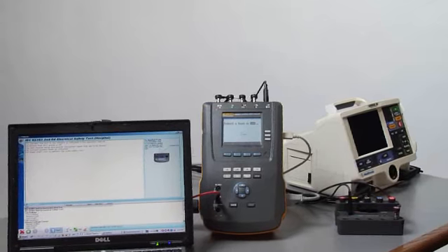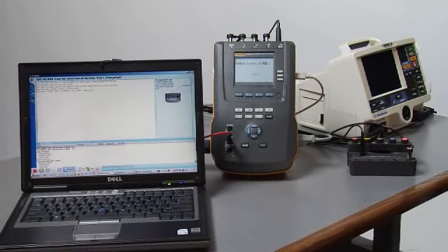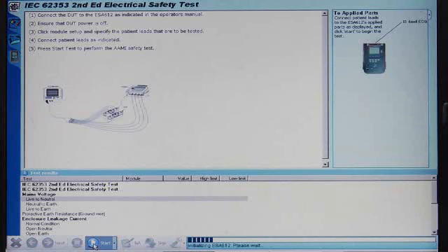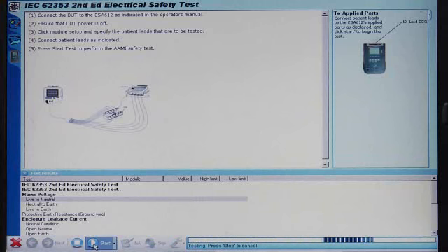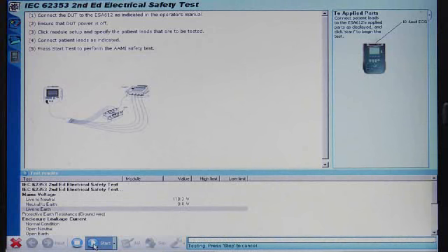It's easy to automate electrical safety testing using test automation systems from Fluke Biomedical. All one needs to do is launch a test procedure that's been previously created by double-clicking and then clicking the Start button after following the instructions for connecting up the medical device. The auto sequence automatically communicates to the test instrument and configures it for the test, and then reports the test results and measurements as it goes through each step in the auto sequence.